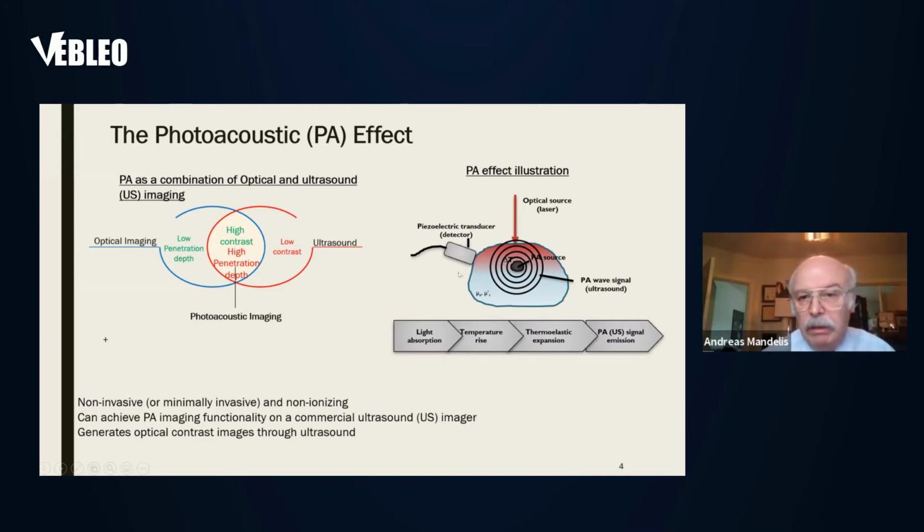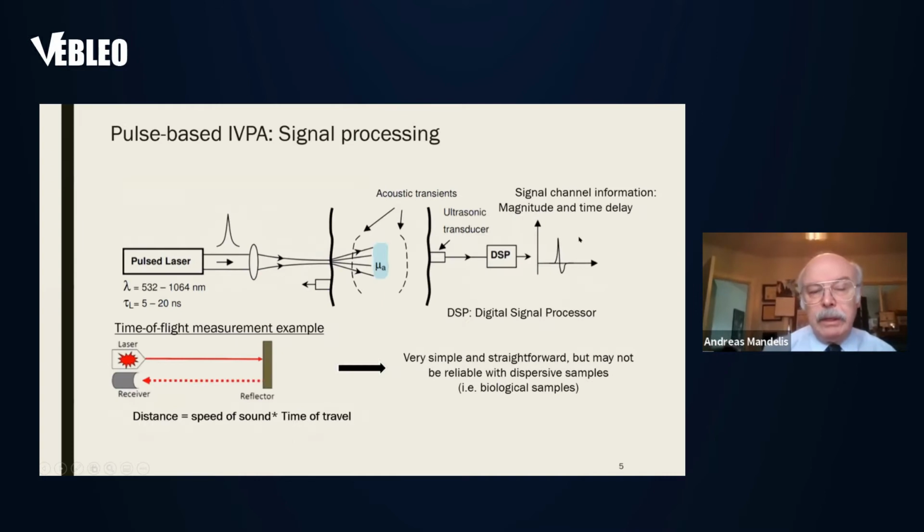So also importantly, we have the technology, because ultrasound imaging has been around for many, many years in the field of biomedical diagnostics. So we already have the tools to generate and detect ultrasound. And that means that in general, you're looking for systems to generate the optical source that will be eventually detected by a conventional ultrasonic detector.